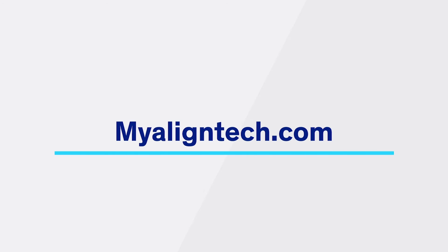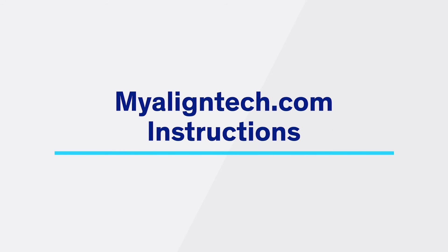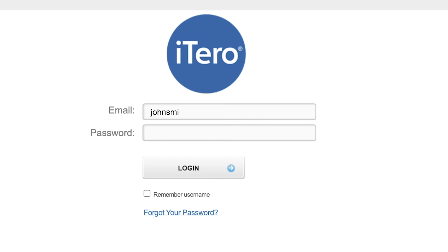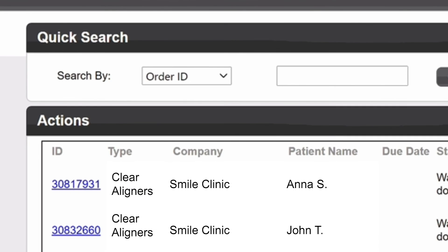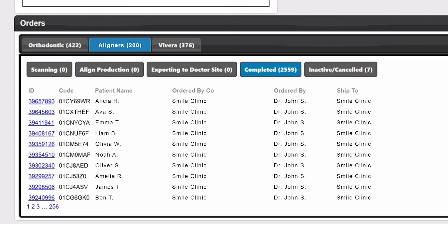To export STL scans from myalignetech.com, follow these steps. Log in to myalignetech.com. Under the Quick Search tab, select your preferred search method. Click on the patient's ID number.